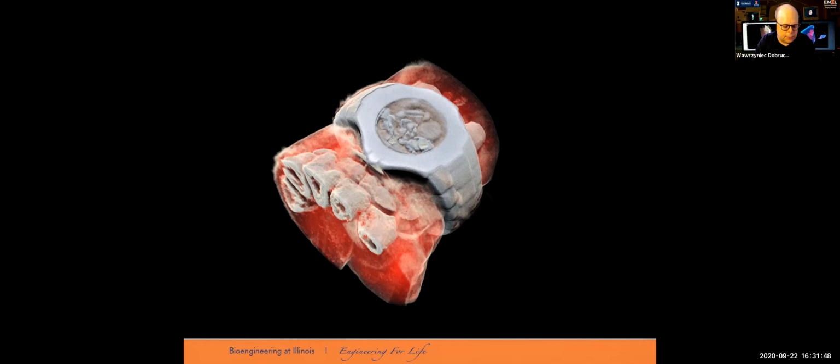And I think we still have 15, 20 minutes, so it's a good time to start the next modality, which will be PET imaging. We'll talk about nuclear imaging, the first one, which uses positrons and annihilation energy to acquire the images, called positron emission tomography. Are there any questions about this part? We can always go back to CT imaging when we talk about the homework on Thursday.